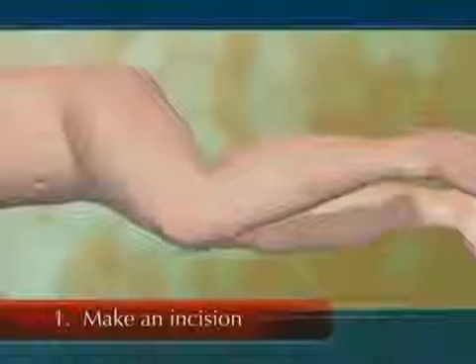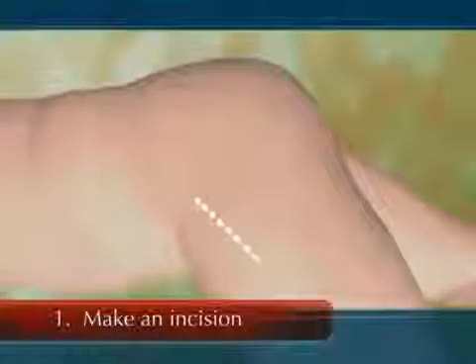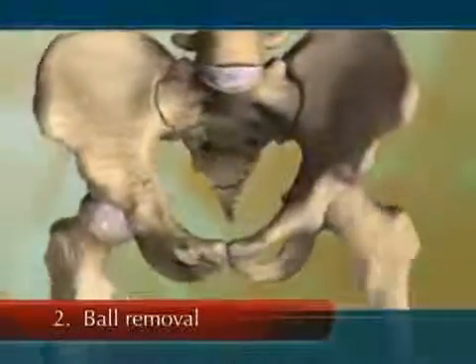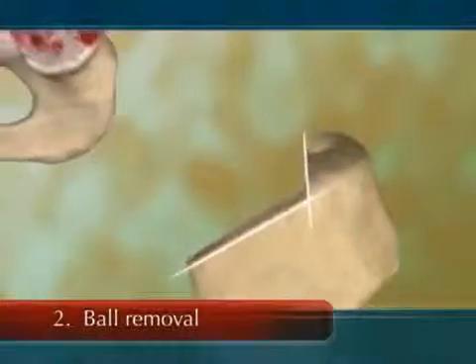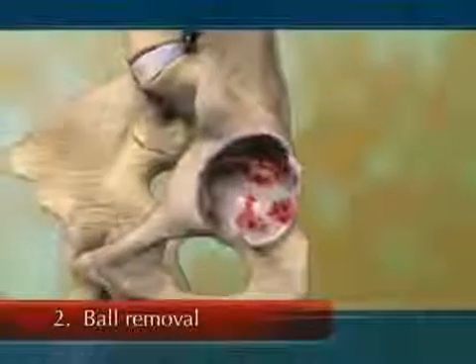To begin the surgery, your physician will make an incision in the skin over your hip joint, cutting through the skin, soft tissue, and muscle to access the hip. Once the hip is reached, the ball is dislocated from the socket and removed from the end of the femur with a saw. The socket, or acetabulum, is exposed.